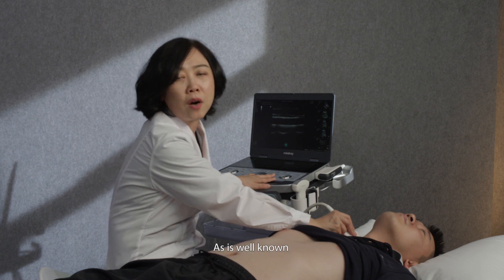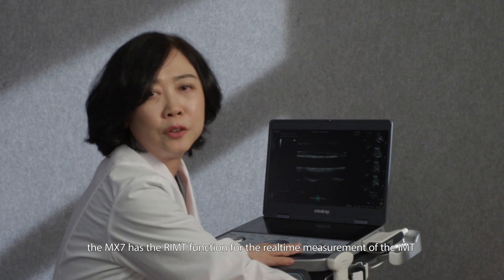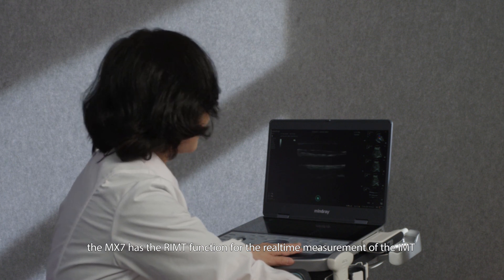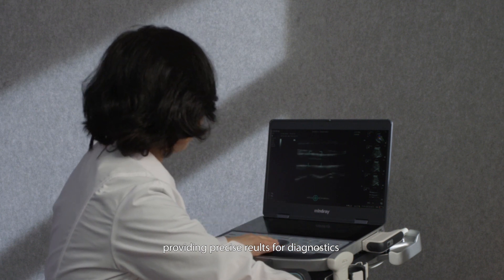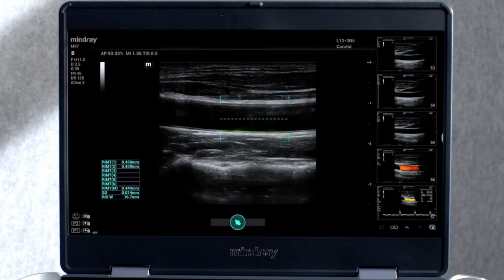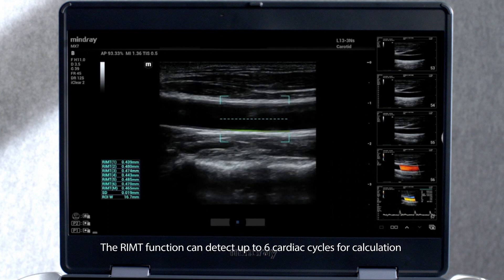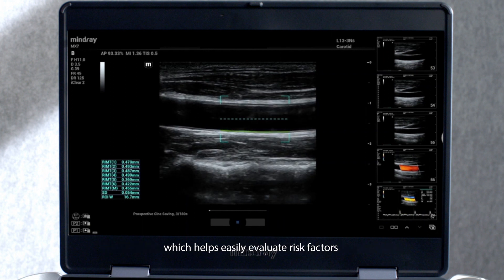As is well known, cardiovascular and cerebrovascular diseases have a higher incidence nowadays. The MX-7 has the RIMT function for the real-time measurement of the IMT, providing precise results for diagnostics. The RIMT function can detect up to six cardiac cycles for calculation, which helps easily evaluate risk factors.